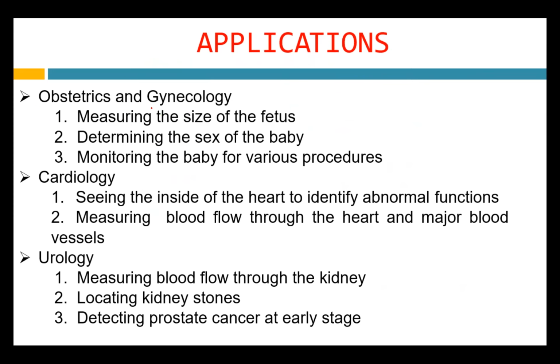Most of the applications are used in gynecology, so that's why they prefer girls for ultrasound service and ultrasound sales as application engineer. In gynecology, ultrasound plays a major role in imaging, to measure the size and diameter of the fetus. In India the gender-telling application is banned, but in the US and other foreign countries they will say the gender in the third scan or fourth scan.